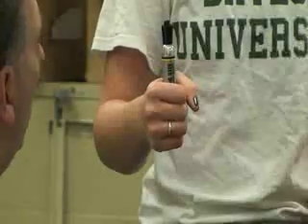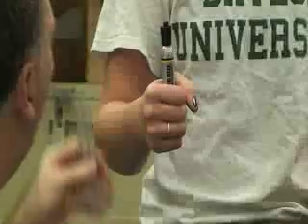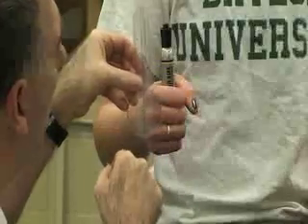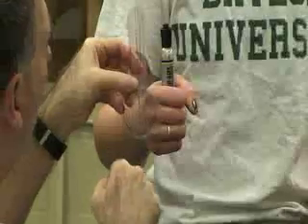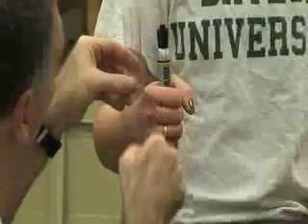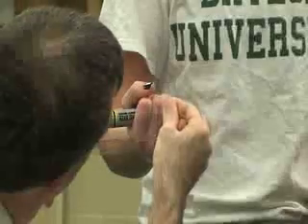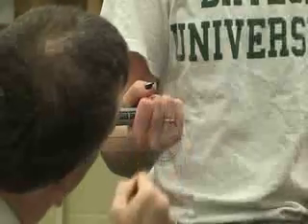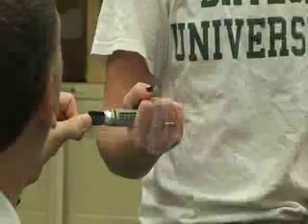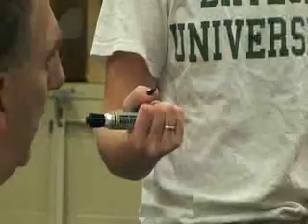Next we're going to do supination using the same setup — 90 degrees of elbow flexion and she's going to be holding a pen or pencil in her closed fist. We're going to align the fulcrum to the third metacarpal. The stationary arm is going to be perpendicular to the floor or table and the moving arm is going to be parallel to the pen or pencil. We'll ask her to do supination. This should be perpendicular to the floor, this should be in line with the third metacarpal, and this should be parallel to the pen. The average again is 80 degrees.